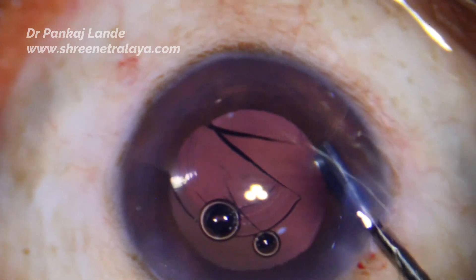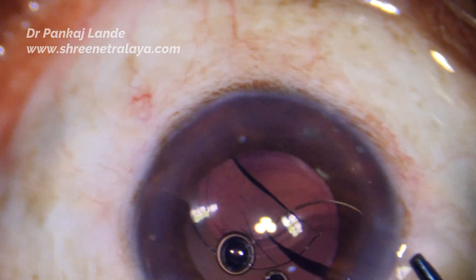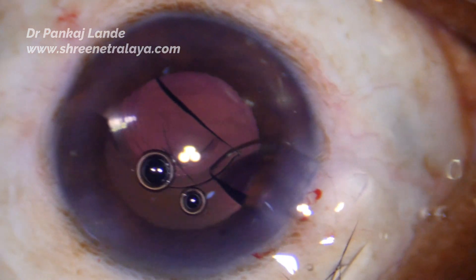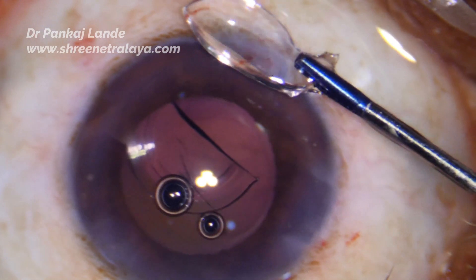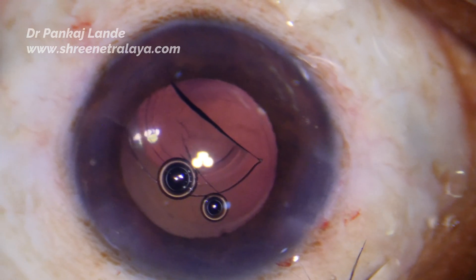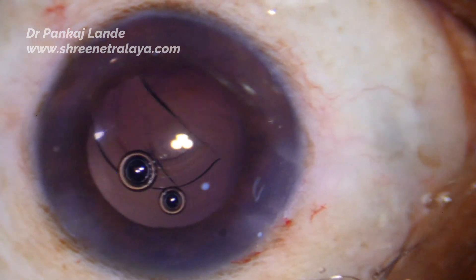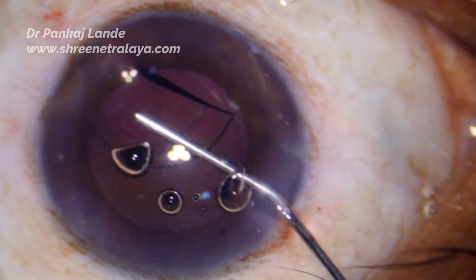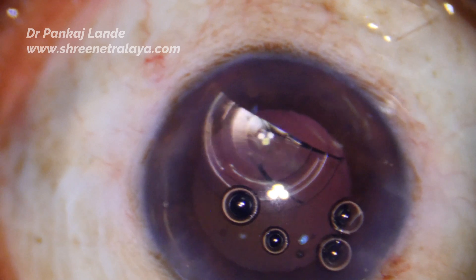To debulk the anterior chamber and allow better manipulation, I removed one piece of IOL which is now ready to be removed — removing it through a 2.6 millimeter incision without any extension. First piece is removed. Again, have a well-filled anterior chamber. Use a slightly higher density viscoelastic in such situations — that helps protect the endothelium, push the posterior capsule back, and give more room for manipulation.